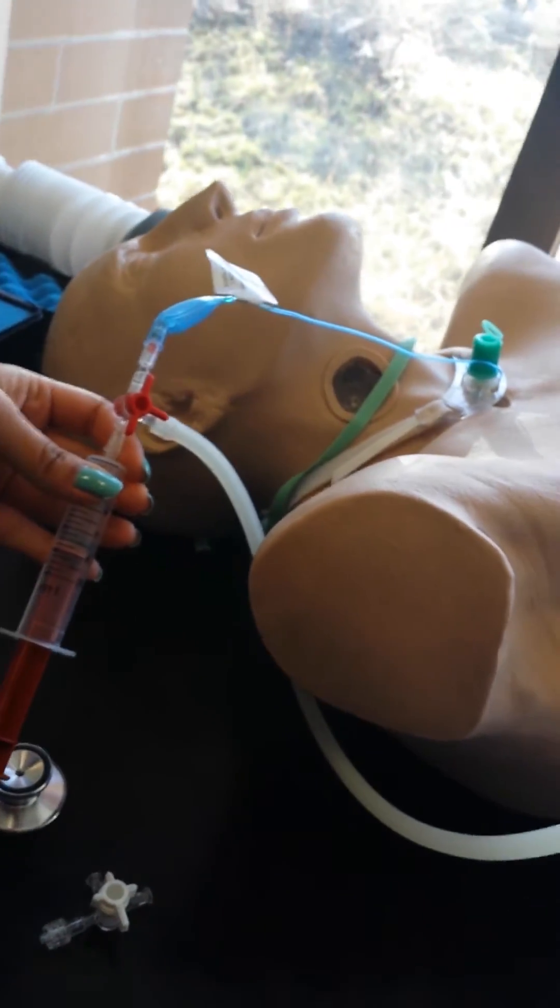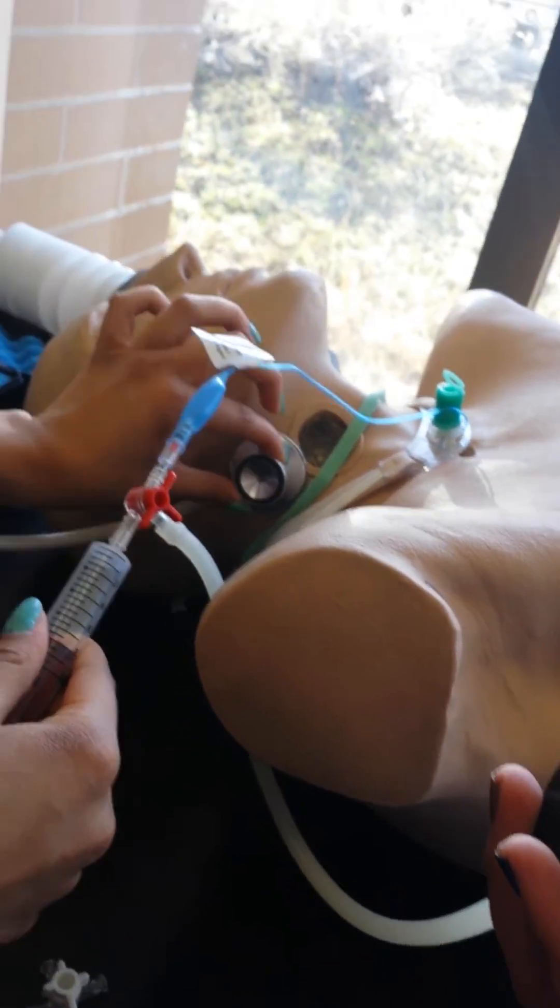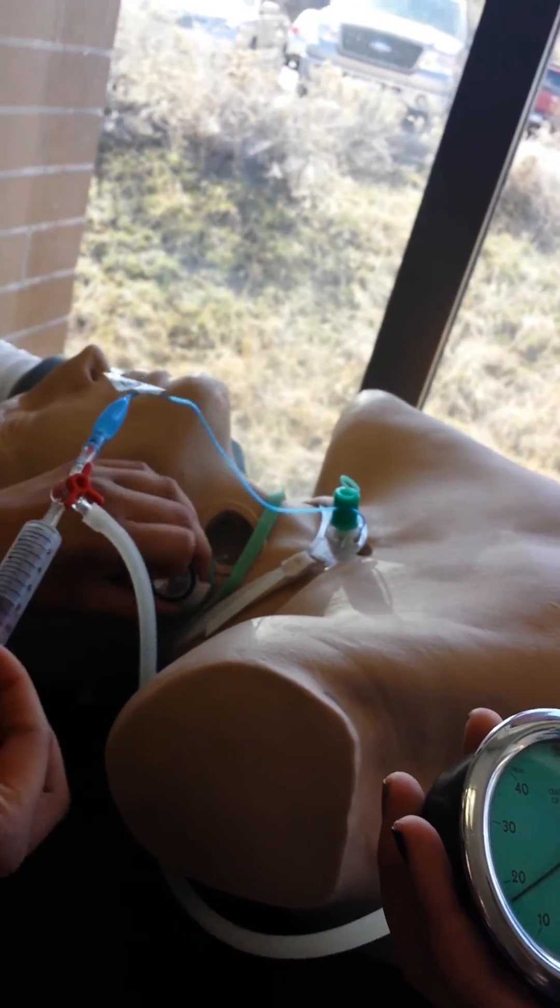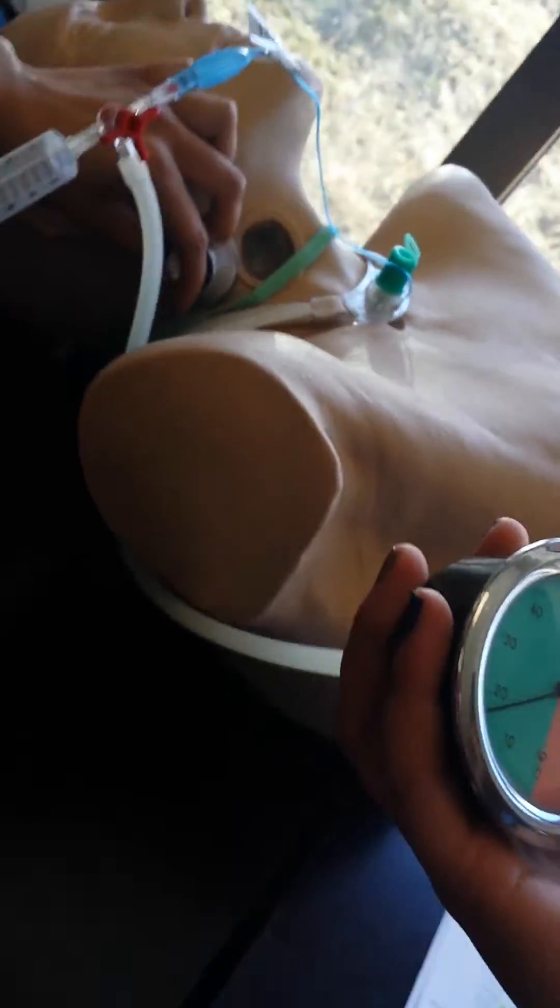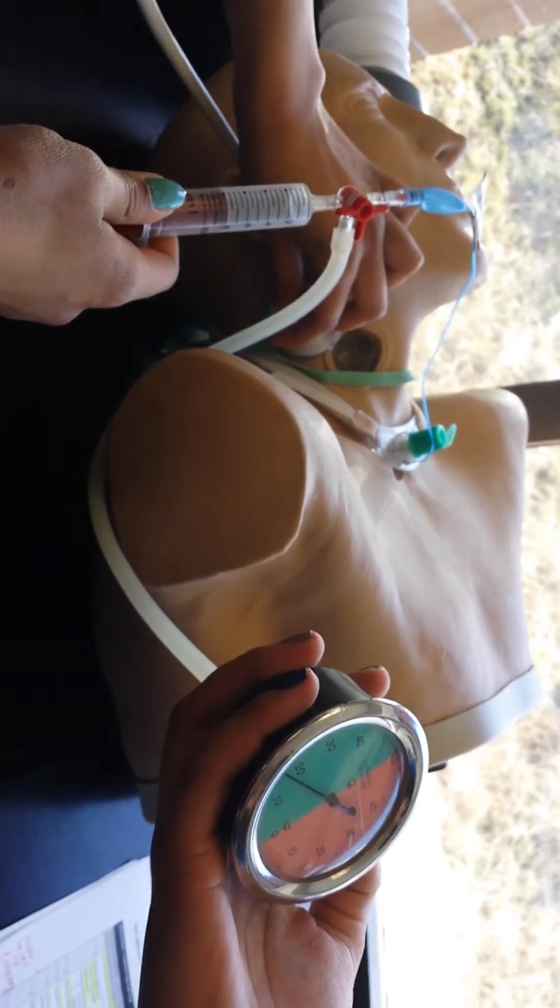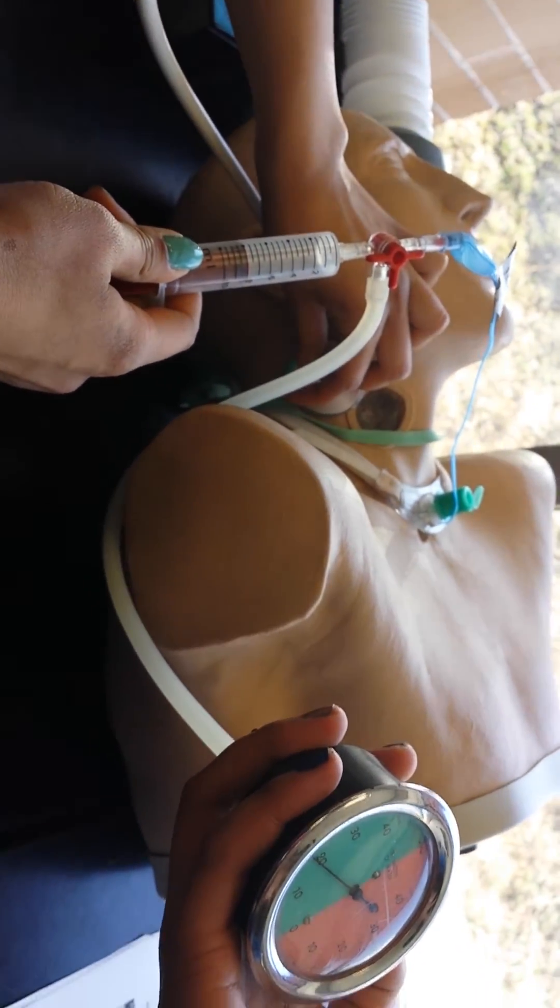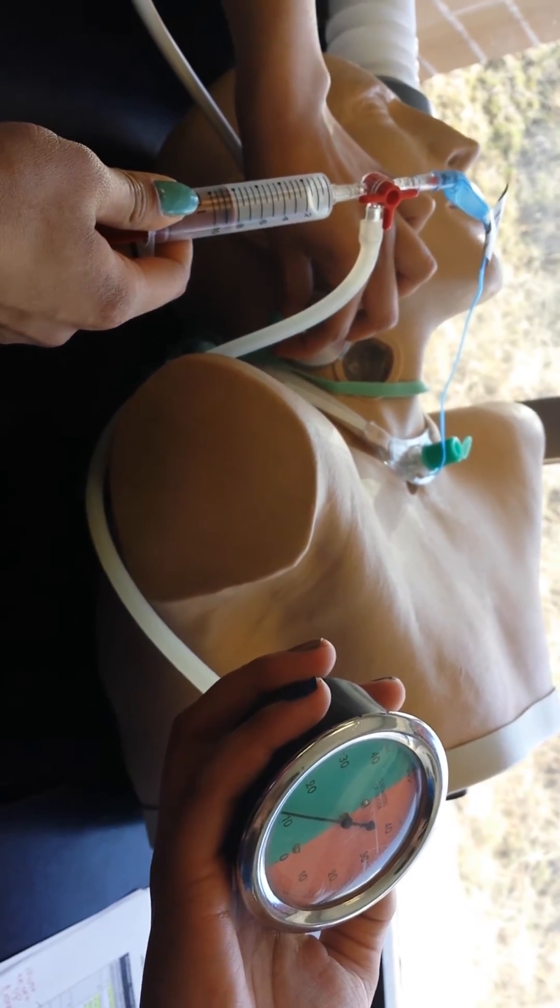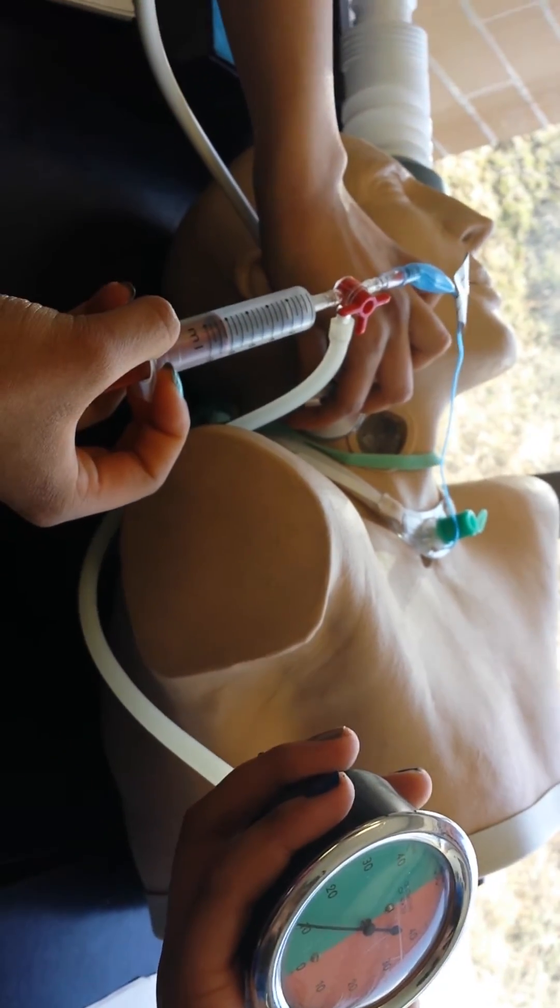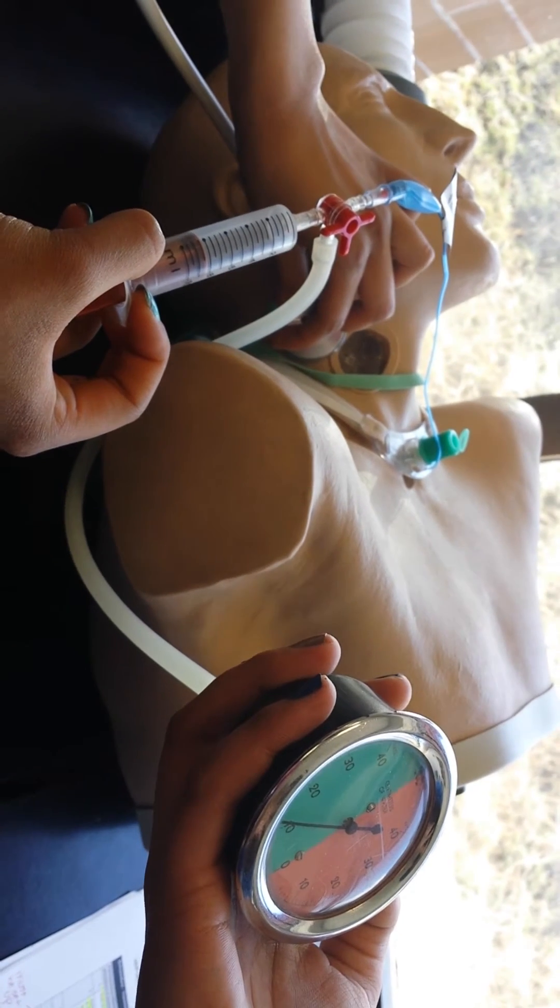So now you're going to have to take your stethoscope and you're going to put it on there. And at this time someone's going to be bagging and then they're going to tell you like loud noise, not loud noise. So you're going to start pulling the pressure out. So it's going to be like no noise, loud noise. And then at that point you're going to start putting pressure back in and you're going to make it go up.